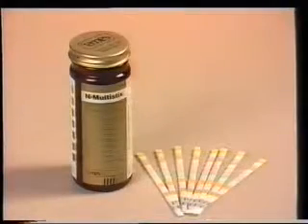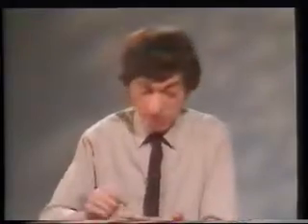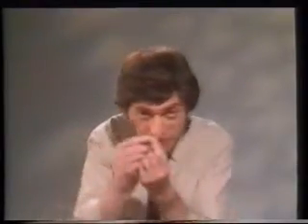Urinalysis, examination of the urine, can really reveal a whole lot of conditions, of chronic conditions and acute conditions. And the development of these chemical reagent strips has really simplified enormously the development of convenient testing methods. And although these strips appear very simple, they're cream and they go green or they go pink or whatever it is, they appear terribly simple. They're actually very complex chemical materials. They're actually a sort of whole little laboratory mounted in a tiny little pad, because there are chemical substances in these pads that change colour when the desired compound is present in the urine, whatever it is, blood, or nitrite, and so on.